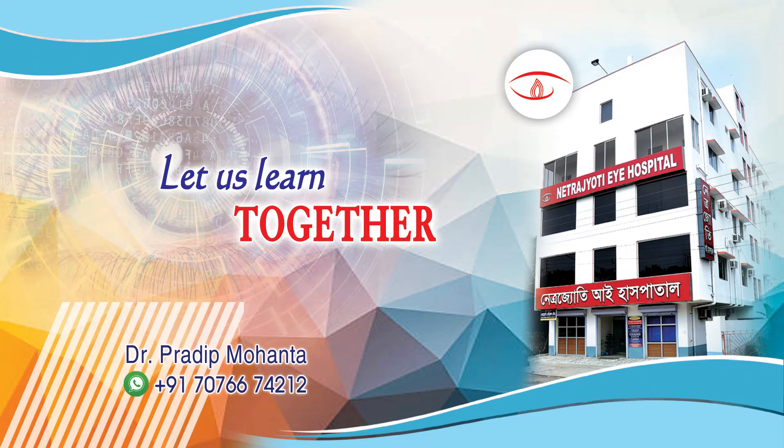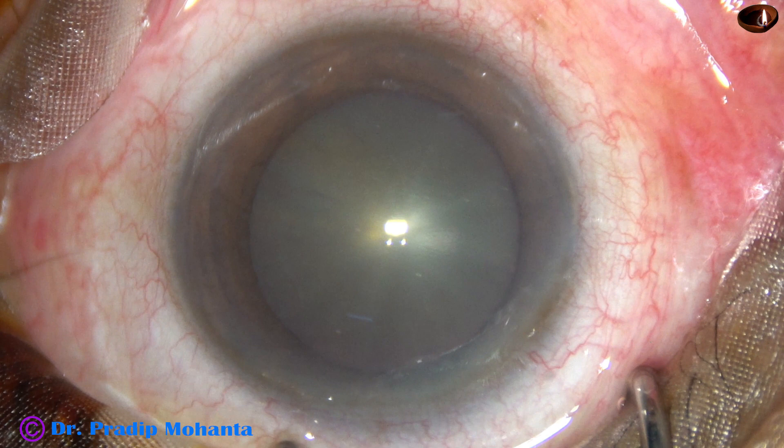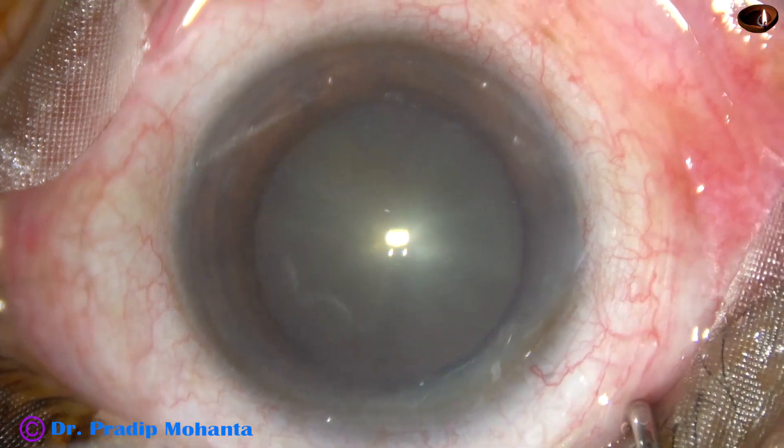Friends, welcome to my workplace at Ranaghat, West Bengal, India. This is a cataract with grade 2 nuclear sclerosis — a very soft cataract. Let us observe this surgery.